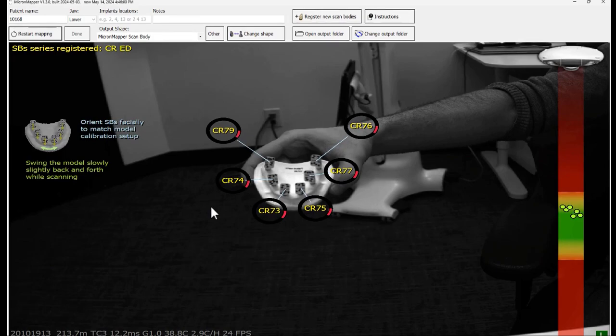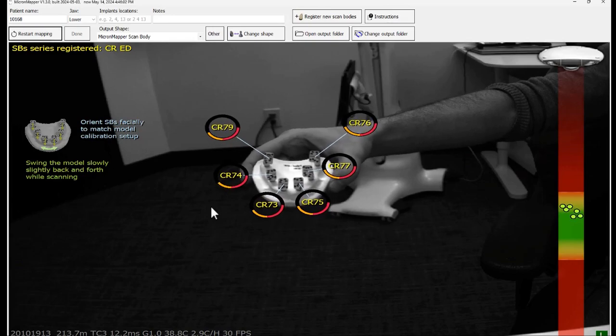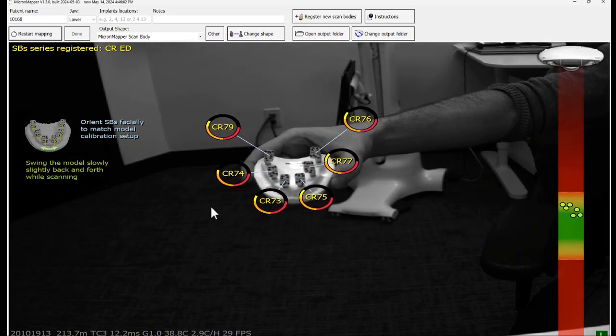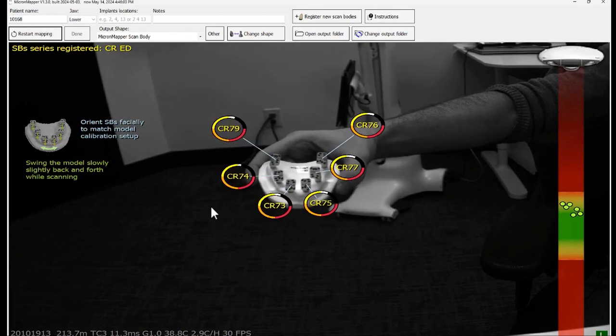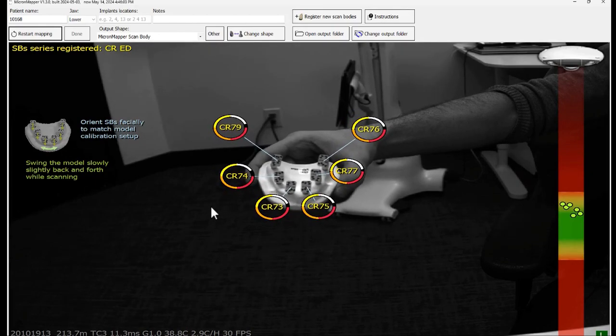To complete this process, move the stone model right, left, up or down. Notice that the circle line is loading for a particular scan body and there are sounds which indicate the calibration is in the process.